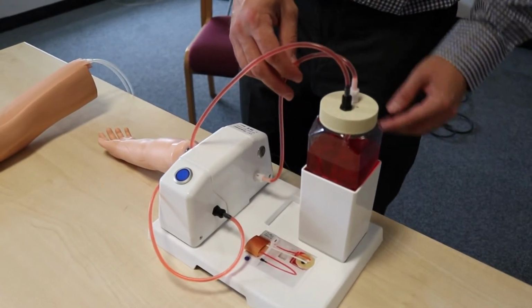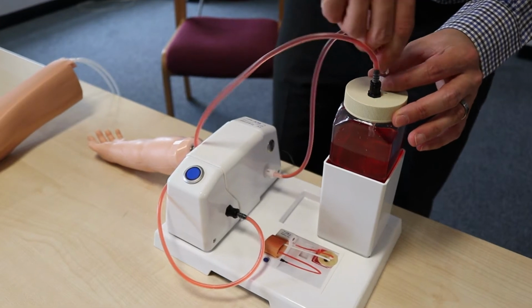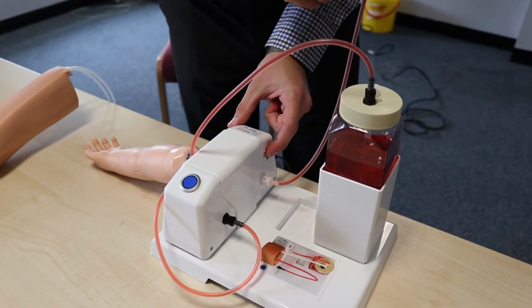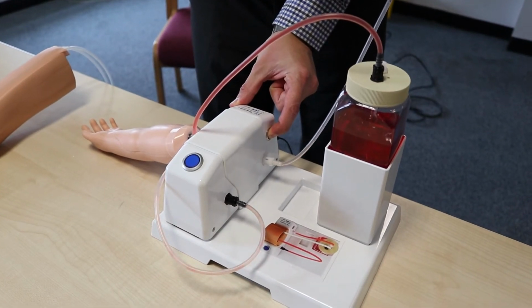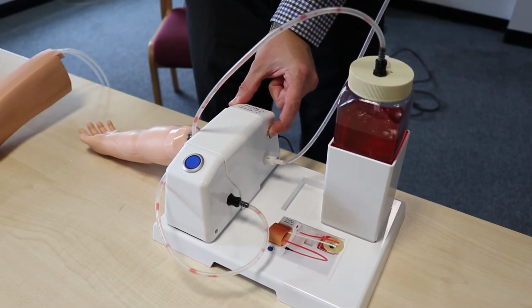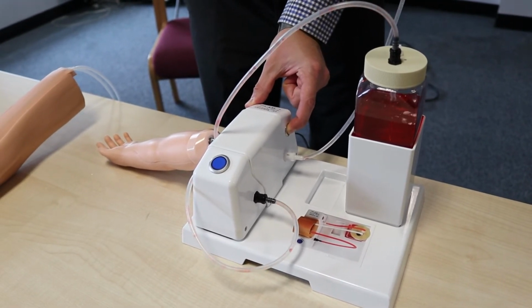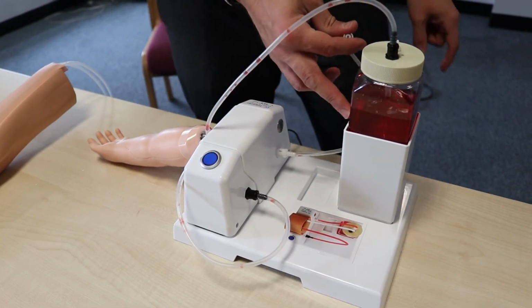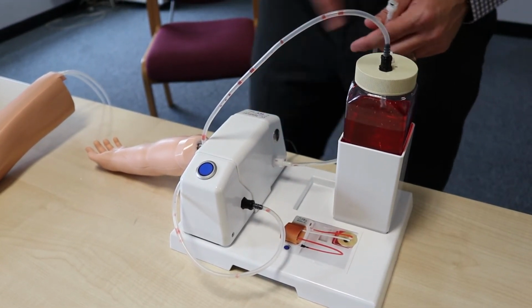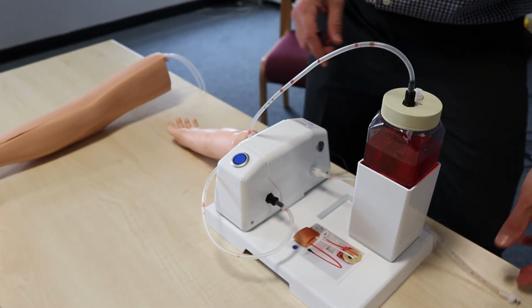So to empty it, we just do the opposite of what we did to fill it up, which is remove, unscrew that white connector, and then push the silver button to run the pump. And you can see the blood runs through. And then what I'll do is empty that out, put some clear water in there, and then just run it through and empty it one more time, which will take about 20 seconds, and that'll be done.